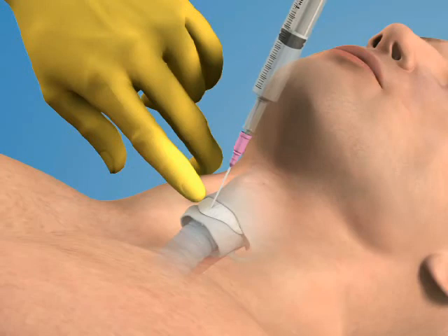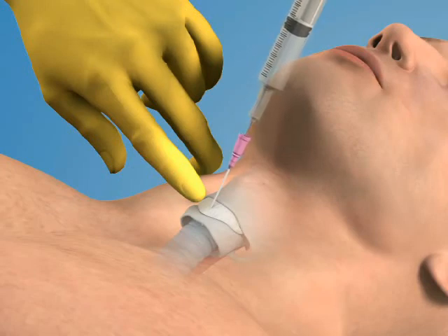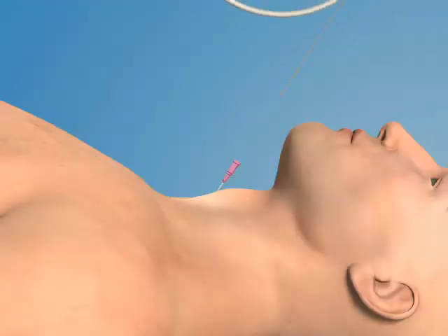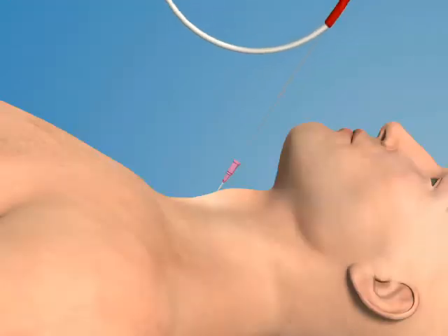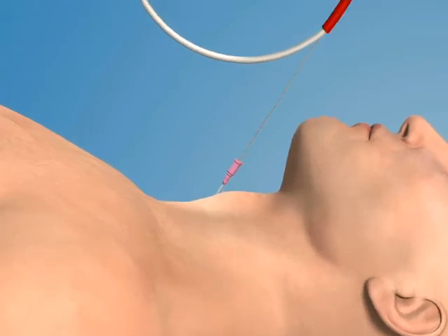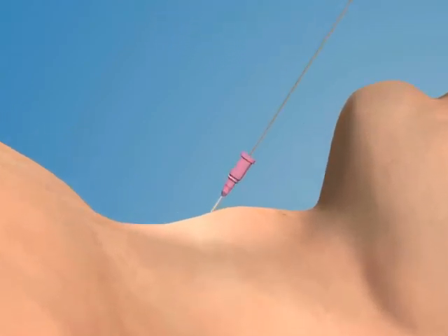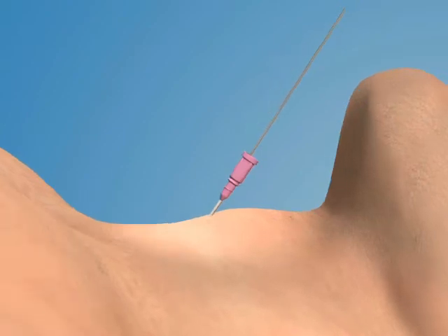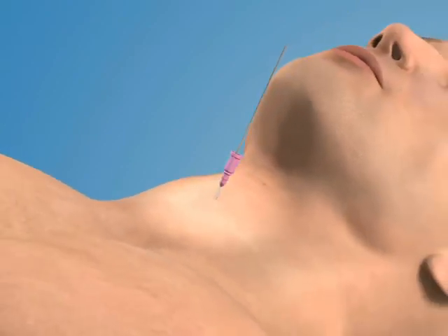Once proper needle position has been confirmed, advance the catheter over the needle and into the trachea. Next, thread the guide wire through the catheter and into the trachea. While maintaining firm control of the guide wire, gently remove the catheter.